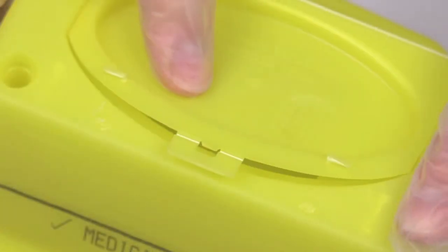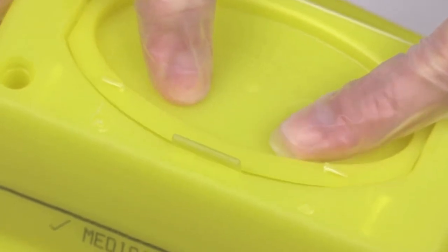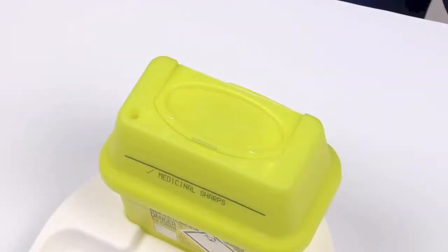Always return the SharpSafe container to the temporary closure position after use. The temporary closure feature should always be engaged when the container is not in use.